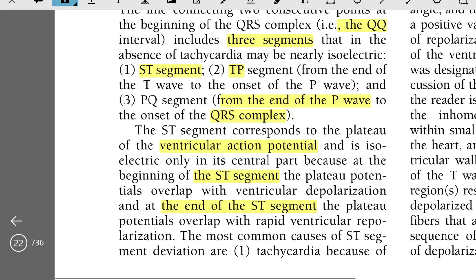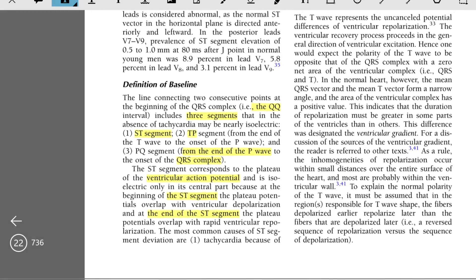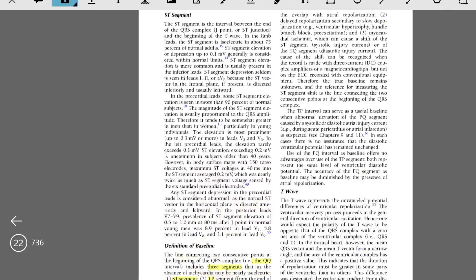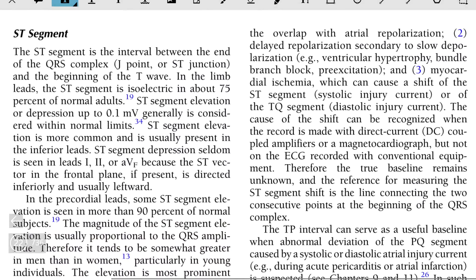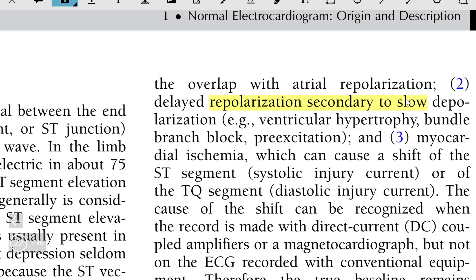The most common causes of ST segment deviation include: tachycardia, due to overlap with atrial repolarization; delayed repolarization secondary to slow depolarization; ventricular hypertrophy; bundle branch block; pre-excitation; and myocardial ischemia, which can cause a shift of the ST segment due to a systolic injury current or of the TQ segment due to a diastolic injury current.